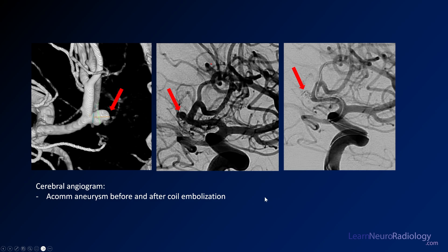Here you see it again in the coronal view, and in the sagittal view — this is a four millimeter aneurysm. If you do an angiogram, you can see the same thing: your carotid, your A1 segment, and this laterally directed outpouching off of the ACOM. You can do 3D reformats from an angiogram and make some measurements to plan your treatment. They've done endovascular therapy here, placed some coils. You can see on the contrast run there's not very much filling of that aneurysm anymore — this is after coil embolization.